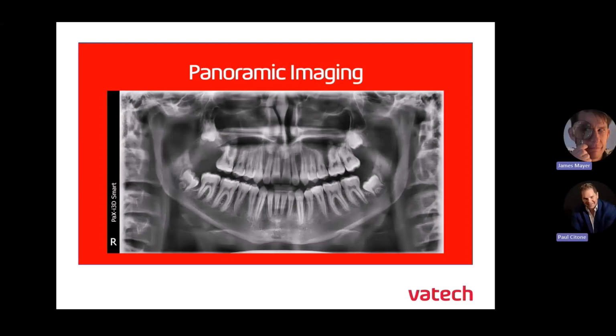So Jim, why don't we talk about some fundamentals of patient positioning and common things that can occur in your images? That sounds great, Paul. I mean, we just finished our patient positioning portion, and now let's look at images. And on screen here, I would consider this a high quality image. I've got my clear anteriors, a nice smile there. My condyles are straight up and down. So the question is, what do we look for in pan image quality?